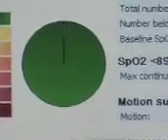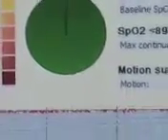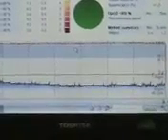And when you see this green, this is actually really, really good. Was he on his side the whole night? Because this is actually pretty good as far as his overall oxygenation goes. I don't see a whole lot of full collapse here. If you go up to the study and double-click the name, it'll give you the specifics here. So this is all night long. And this right here is just this little window of yellow. See this yellow window right here? That's this window down here.